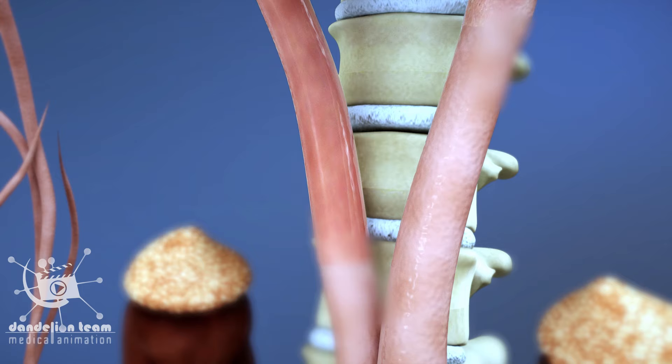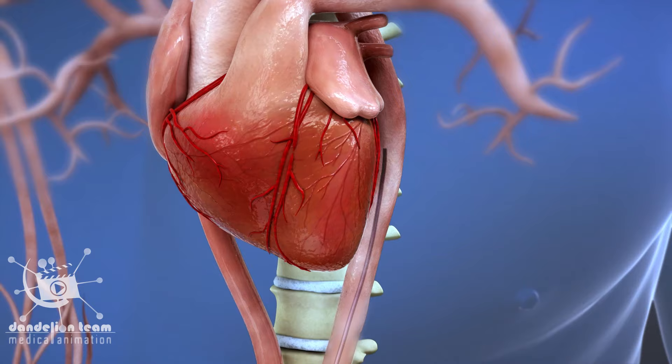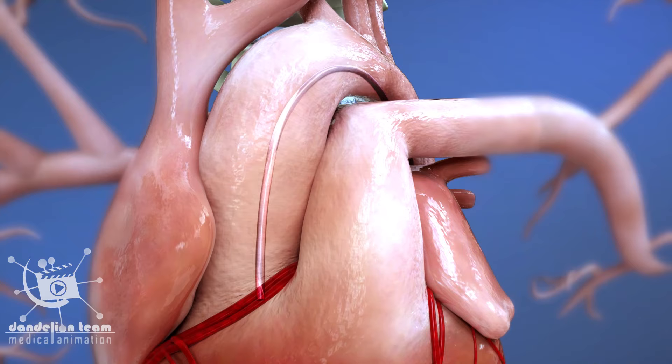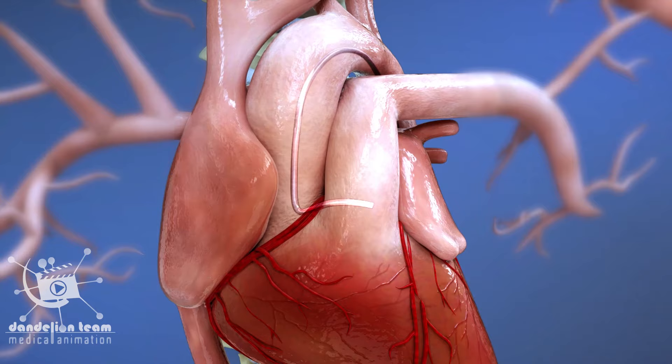The doctor will then navigate a narrow tube known as a catheter up to your heart via the arterial system. Once at the heart, the doctor will direct the tube ending so that it is pointed at the entrance to one of the main coronary arteries.